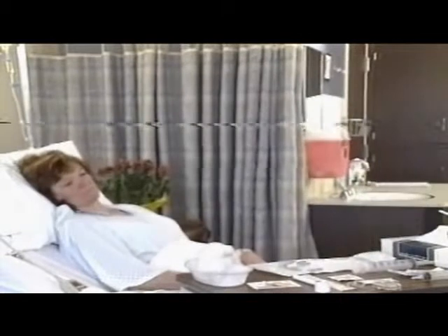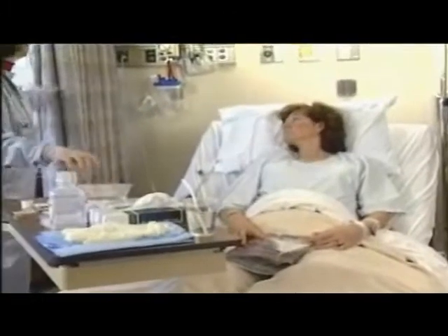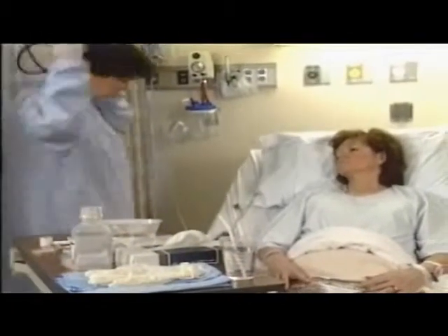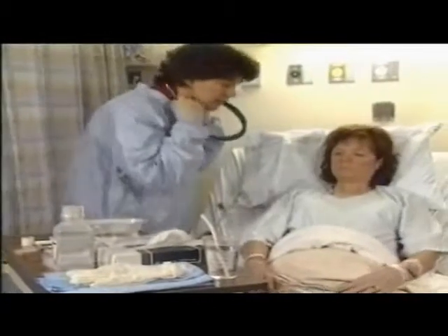Raise the bed to a comfortable working height. Provide privacy for the patient. If possible, stand on the right side if right-handed and on the left side if left-handed.